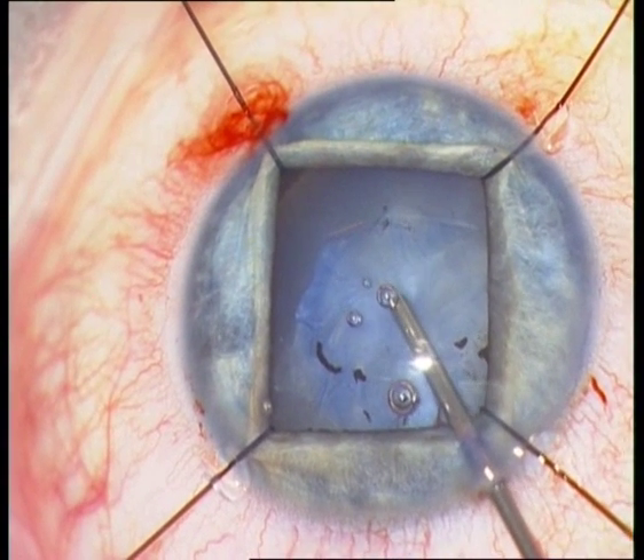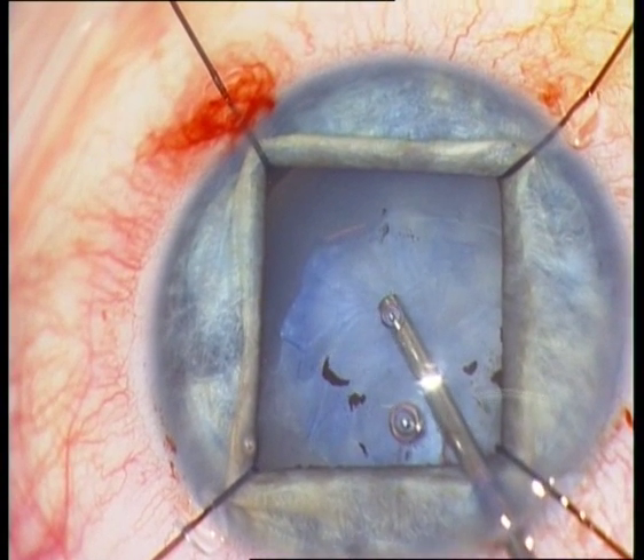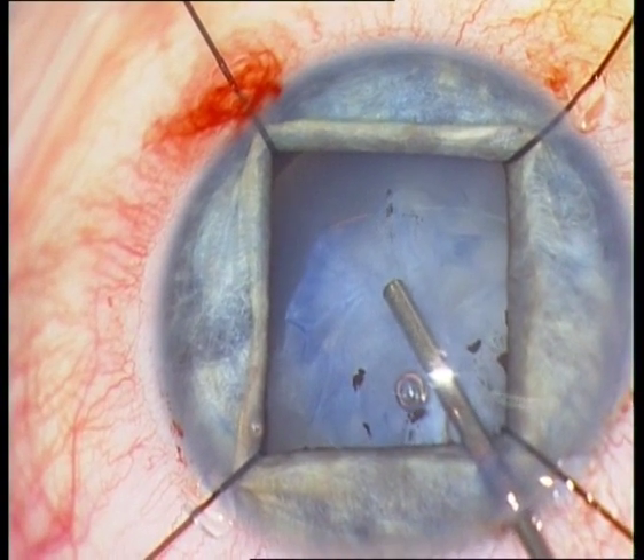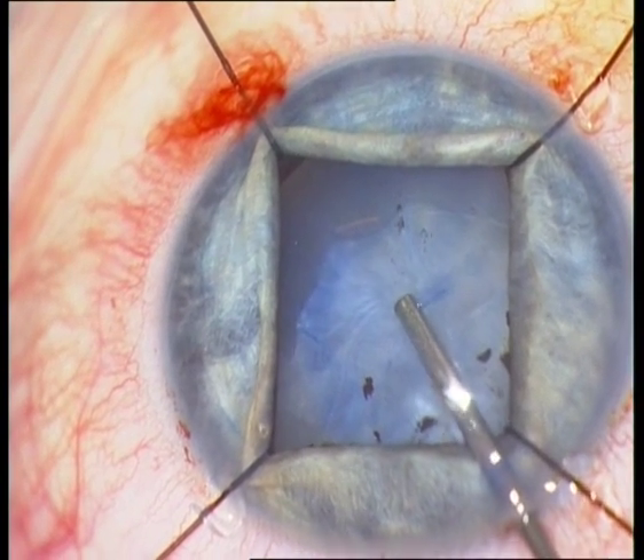Now I am trying to open the anterior capsule with a vitreous cutter, using a very low cutting rate, but I do not succeed.